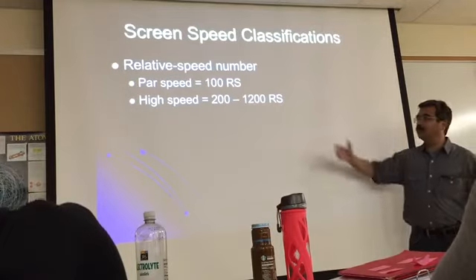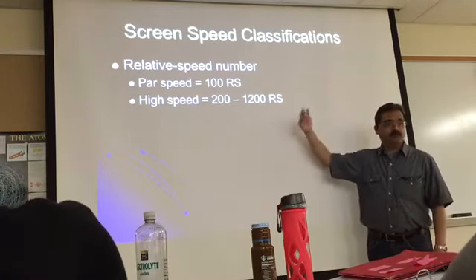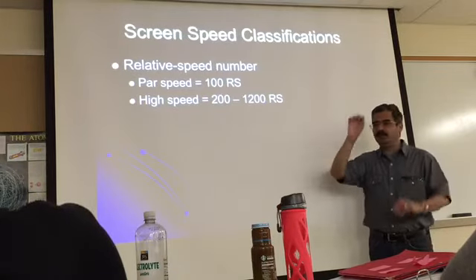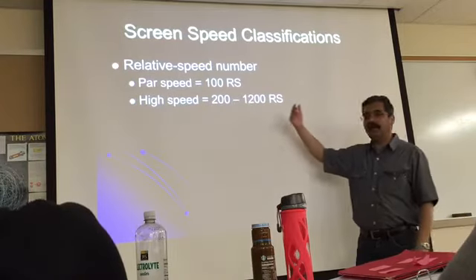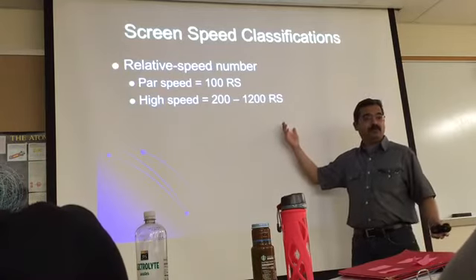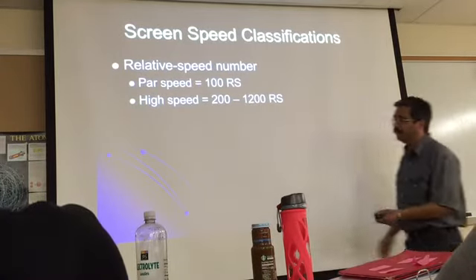So you don't need great detail, and so you could use the higher speeds. Yeah, you're losing resolution, but you're looking just at the vessel. That makes sense? And so that is the case when using a higher speed was convenient. You following me? Okay, good.